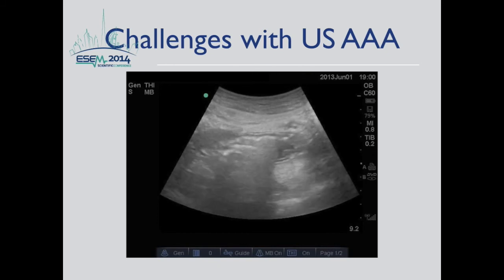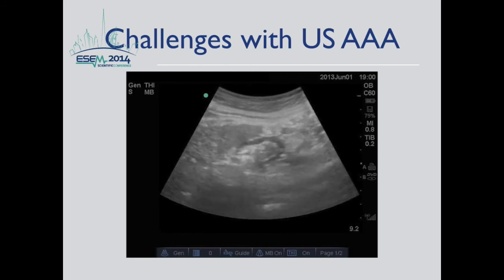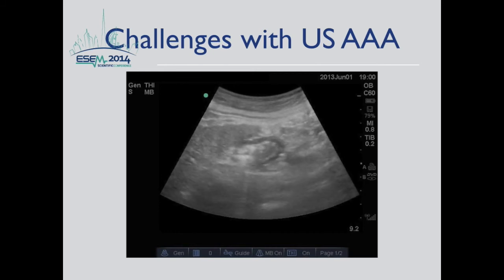Obesity is another challenge that can be addressed by asking the patient to lie completely flat. Have the patient flex their hips and knees to relax the abdominal wall muscles.